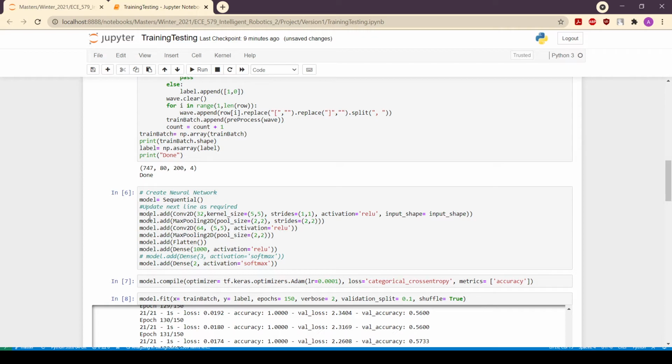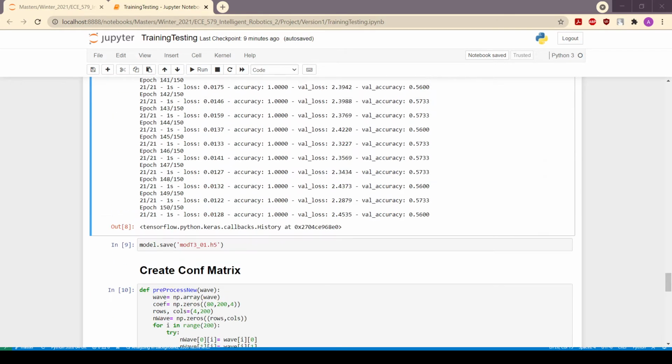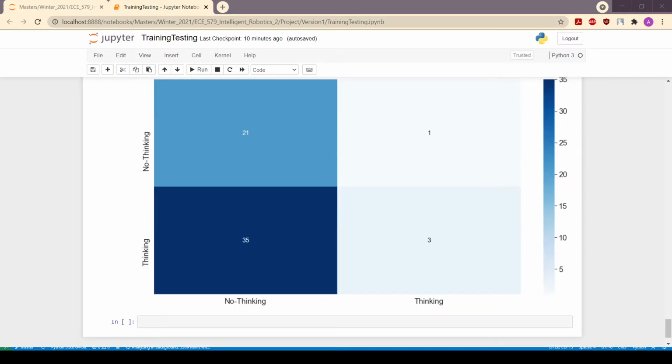After training for 150 epochs, we get an accuracy of 100% with a validation accuracy of 56%, which tells us there has been a lot of overfitting in our training, which means our data was not sufficient. And again, while testing, it mispredicted a lot of things. It correctly predicted 21 of non-thinking and 3 of thinking, but mispredicted 35 of non-thinking as thinking and 1 of thinking as not thinking, which is really bad.